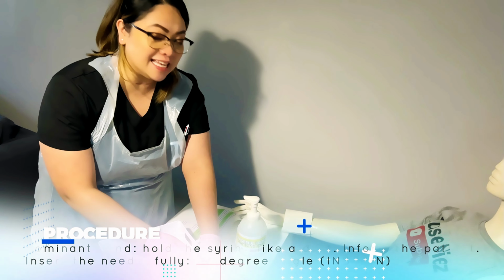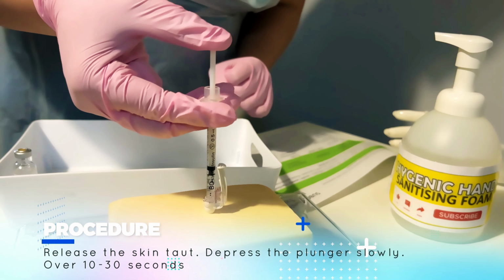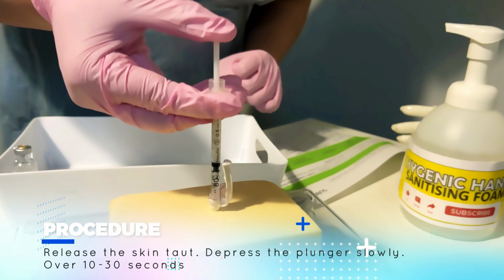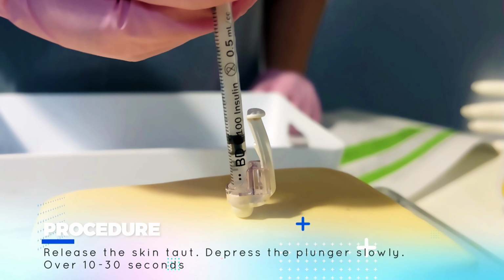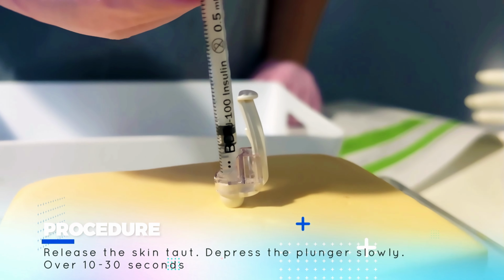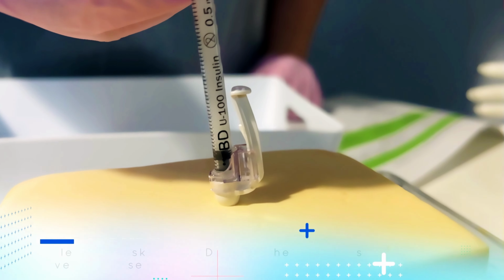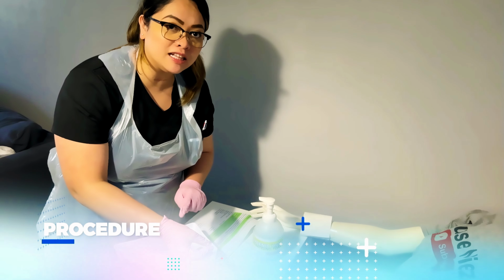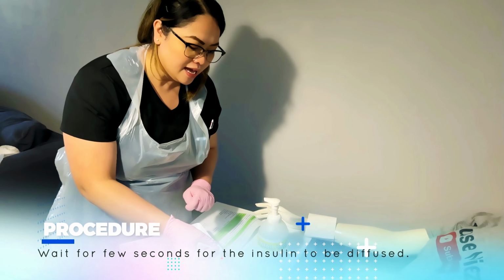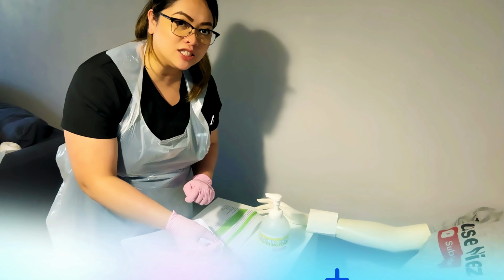I'm going to release the pinch, and I need to depress the plunger for 10 to 30 seconds. 10, 9, 8, 7, 6, 5, 4, 3, 2, 1. Now I need to wait for 10 seconds for the medication to diffuse into the surrounding tissue, okay? 10, 9, 8, 7, 6, 5, 4, 3, 2, 1.